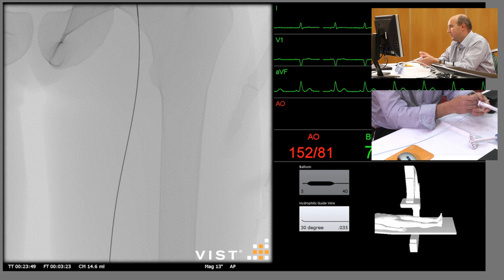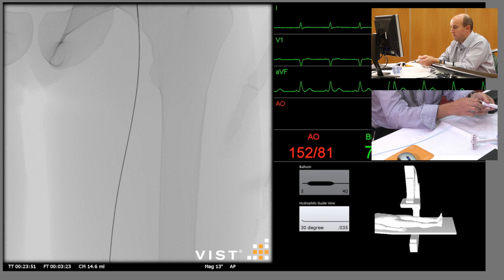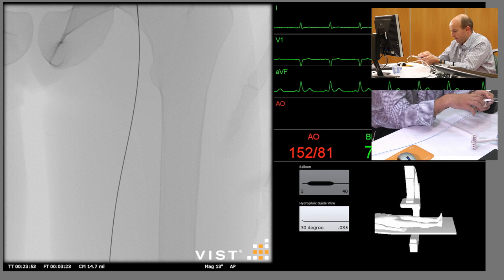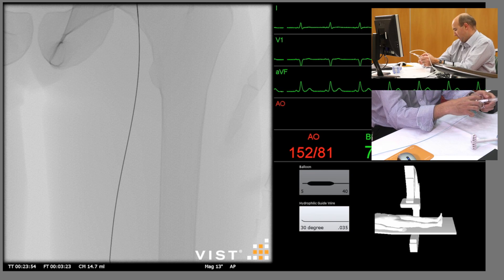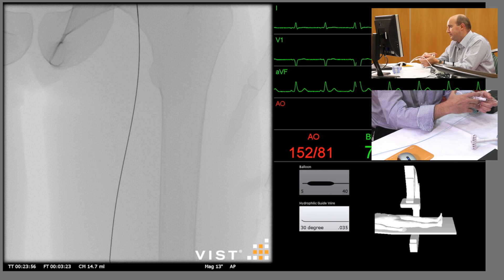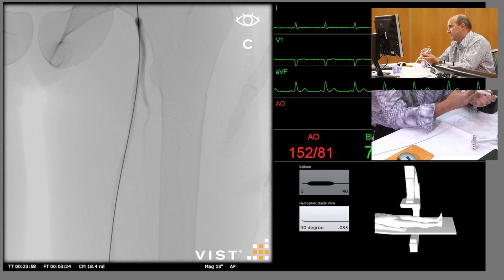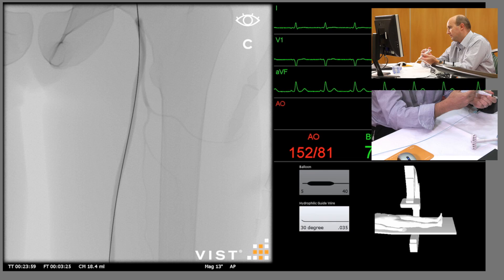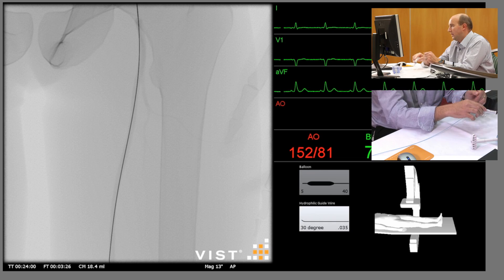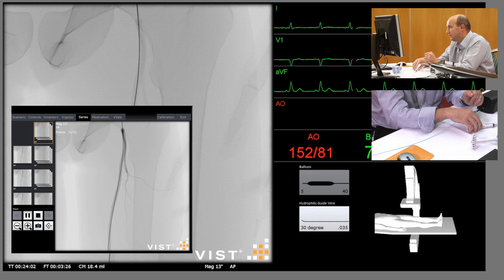And now just do a check angiogram just to make sure that the procedure has been successful. So again, this is just a sheathogram. Right-hand pedal, DSA run. And that looks like it's been a successful result.